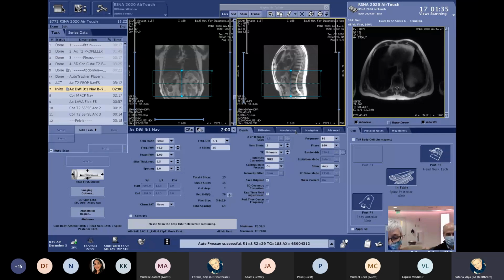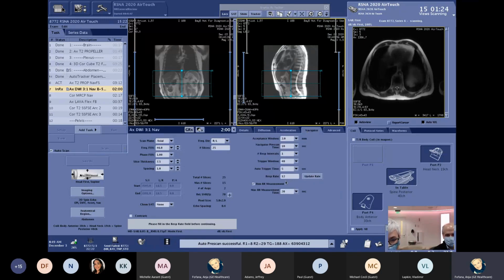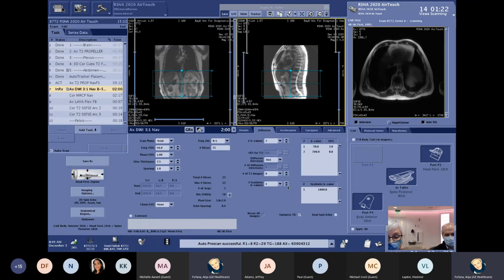Okay. So now the next sequence we're going to show is a diffusion sequence. You see that we have set up two different B values, 50 and 700, and we will use our navigator. On top of the selected B values, I also have selected to synthesize the B value. That is a feature you can do anytime you've scanned two B values. You can synthesize any higher B value, which really gives you the efficiency that you don't have to scan high B values with a lot of averages. Saves you a lot of time, right? Yeah.